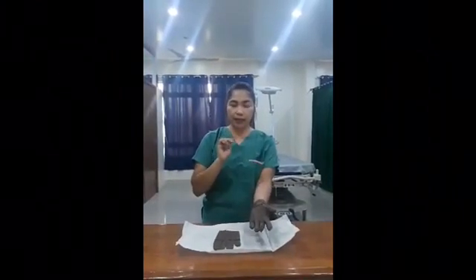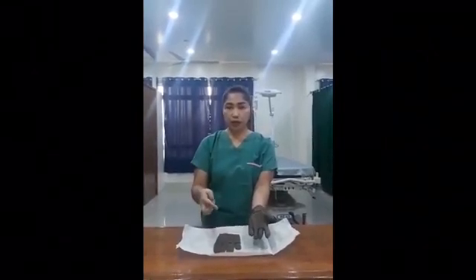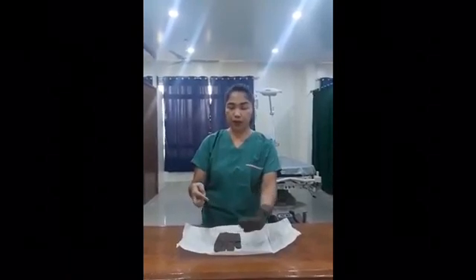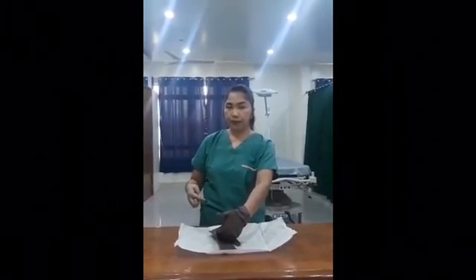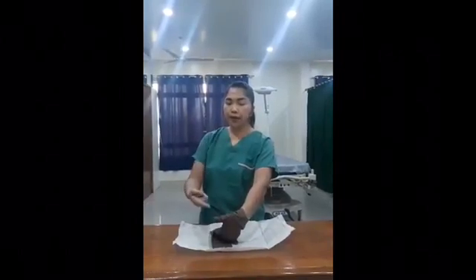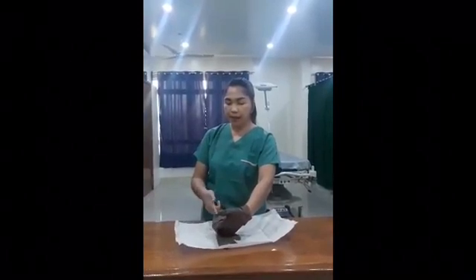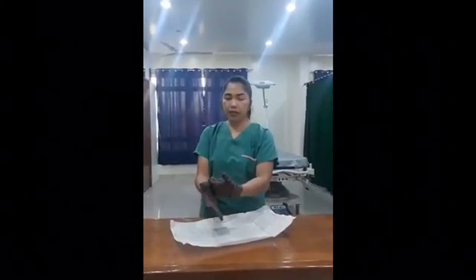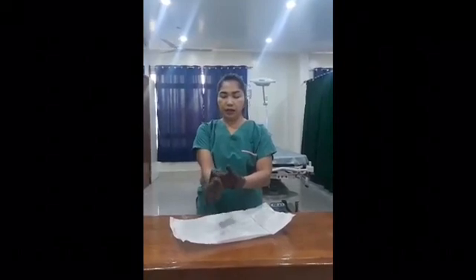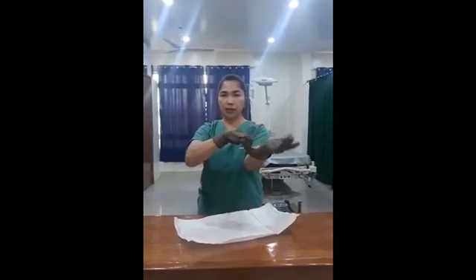Remember, this glove is already sterile, so you are just going to touch it with the sterile portion of the glove. Now I'm going to slip it inside this glove here. Please observe my thumb. And then I'm going to slip my other hand inside — not touching the unsterile area. And then you can adjust your hand.